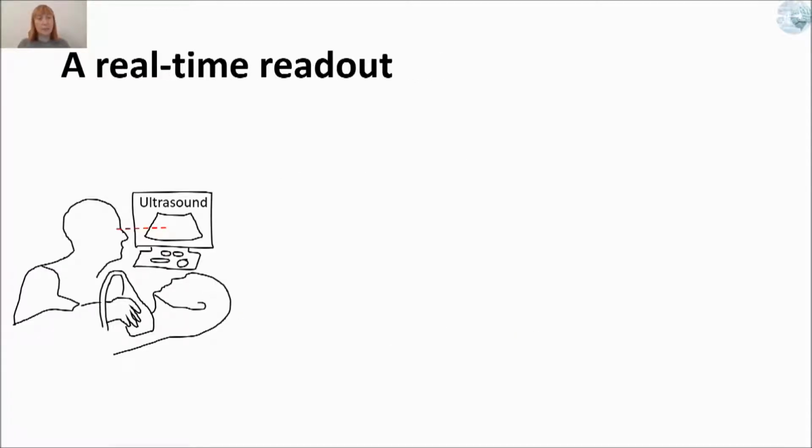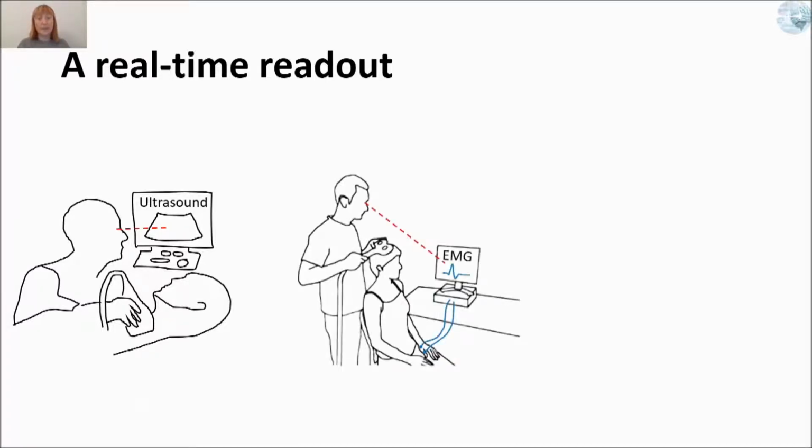This kind of approach is routinely applied, for example, during ultrasound investigation. Here, the operator empirically adjusts the location and orientation of the ultrasound beam to get a robust echo before evaluating a target organ. In the TMS field, this approach is also routinely applied, for example, when measuring peripheral motor evoked potentials.